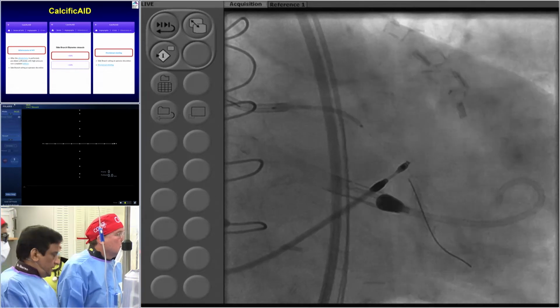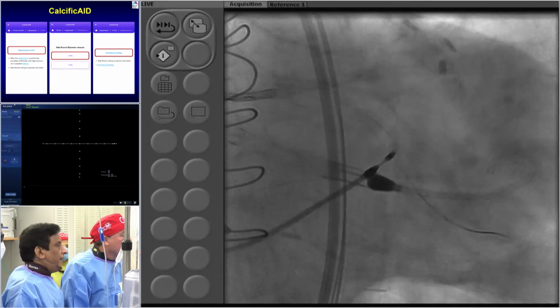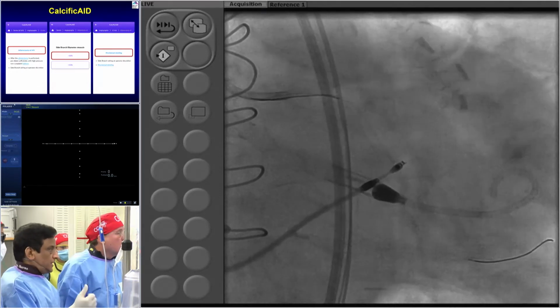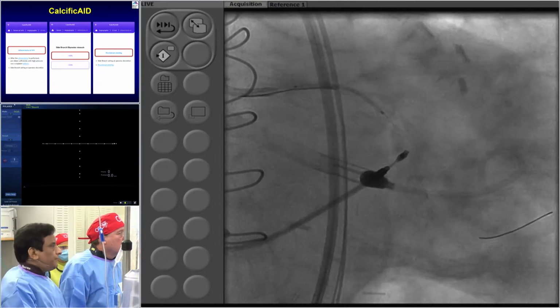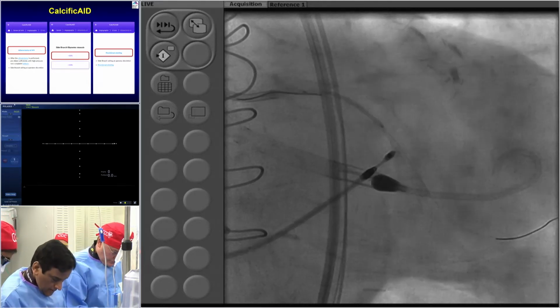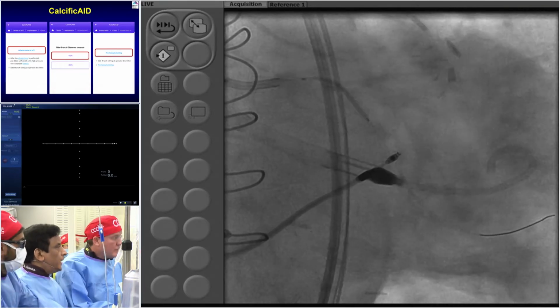Wire first, distally. Advance the wire a little more. The key is the same, making the angle issue. So two things. You have to advance the wire distally to give you the body, and if need be, a second wire. But good, good. You got it. Remove the other wire. Just show us how you're going to position that, Pedro, nicely to our audience. Pull back, please. Pull back.